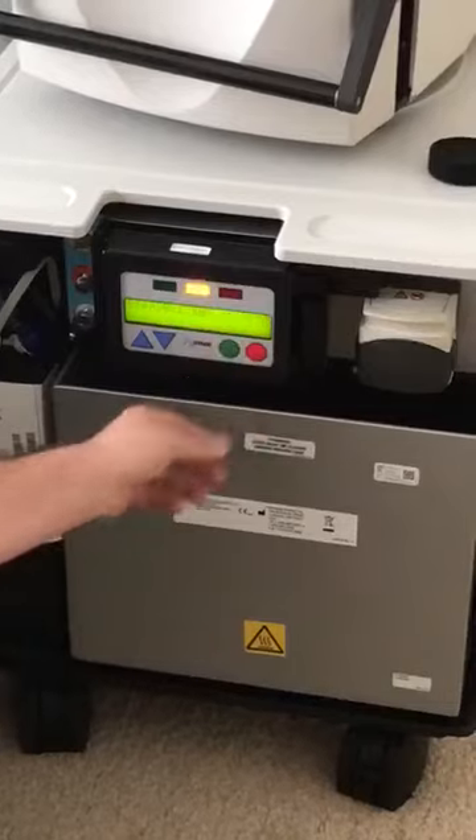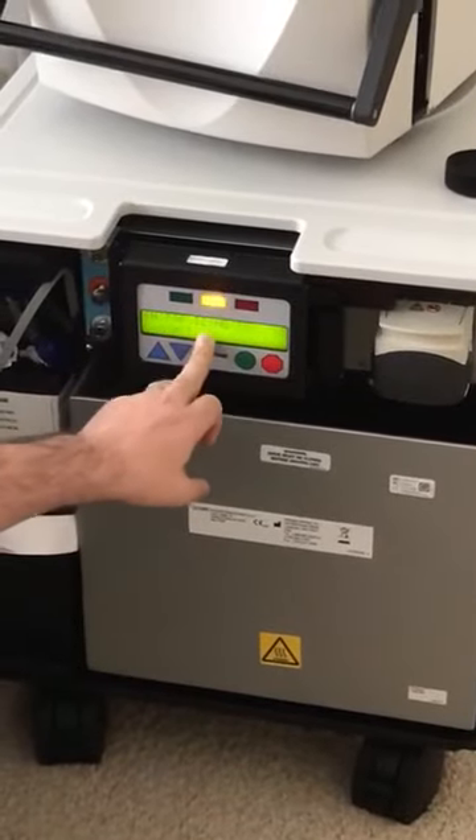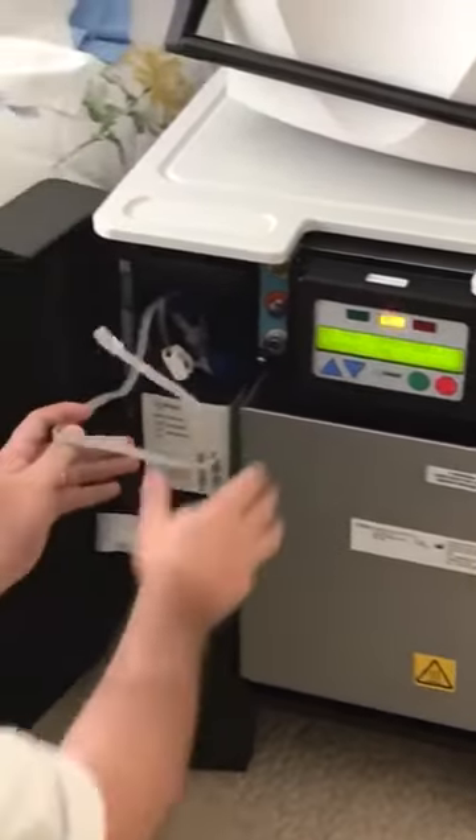Next we're going to press go. As we press go, it's going to tell us that there's no pack connected, so we need to connect the pack.